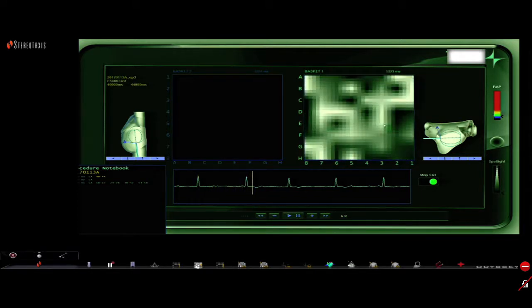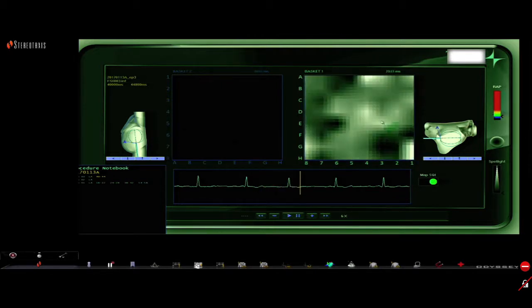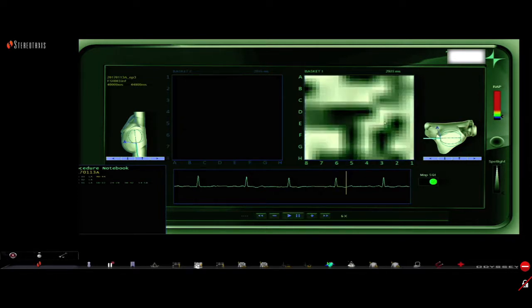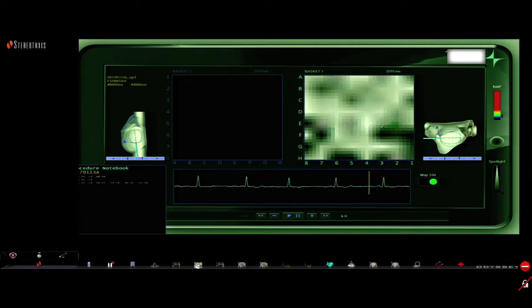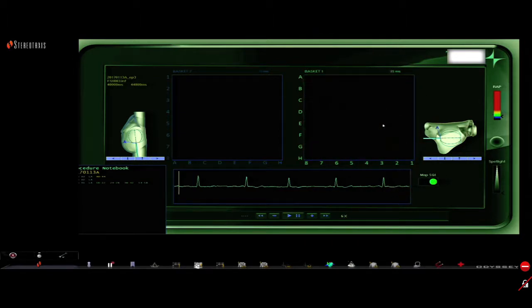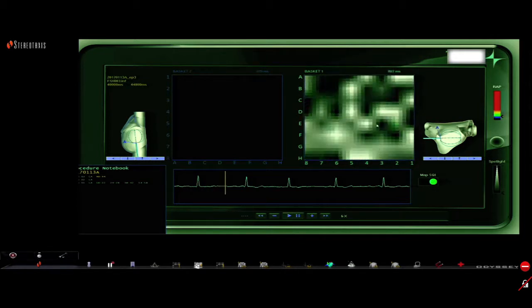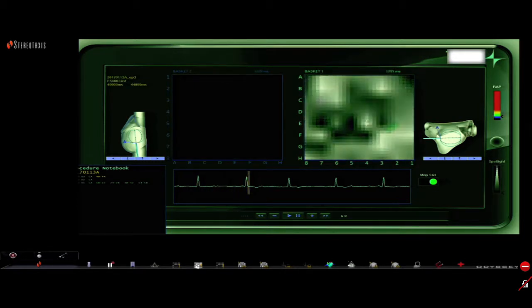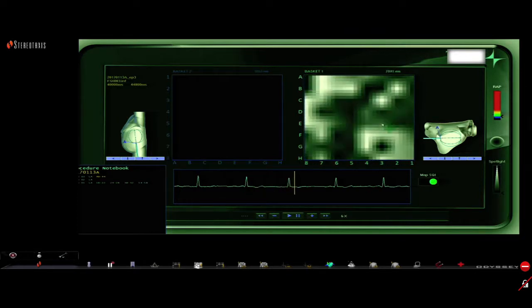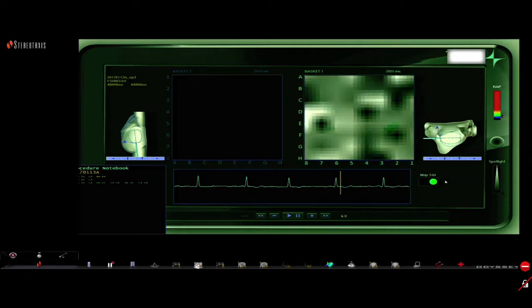What we do now, you can see that this is pretty consistent. It's in the area of where the center is. You can see it as I'm moving it there against the white. And the letter E here is the predominant one, as you can see. And so that's where we're going to go, that area. Take a look at another segment here.